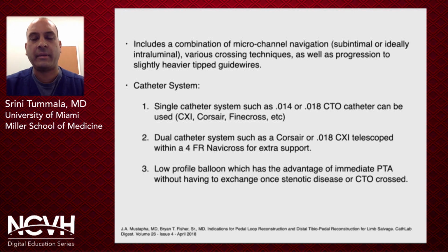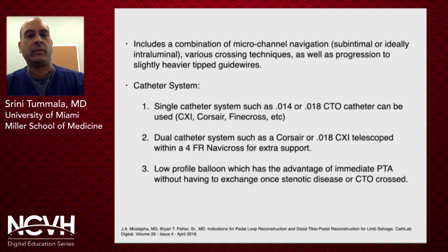Well, it really includes a combination of microchannel navigation, whether it's subintimal or ideally intraluminal, because that has better patency rates. We're obviously going to use various crossing techniques, which I'll describe later, as well as progression to slightly heavier tipped guide wires when you're dealing with these vessels. Because you are dealing with tortuous and small vessels, you really want to understand your catheter and guide wire systems.